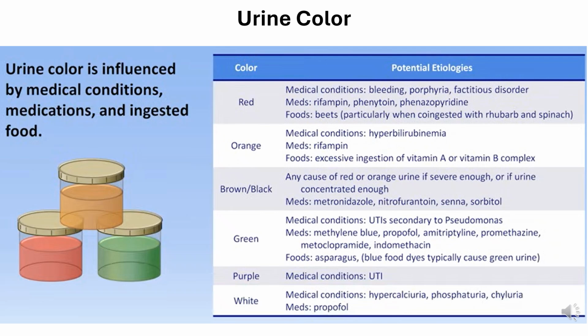Turbidity, cloudiness, can indicate a UTI, pyuria, or precipitated crystals. Nonspecific, do not diagnose a UTI based on cloudiness alone. Always correlate with dipstick and symptoms.